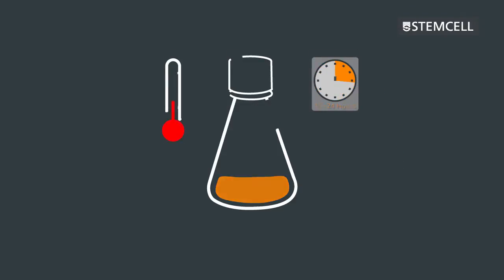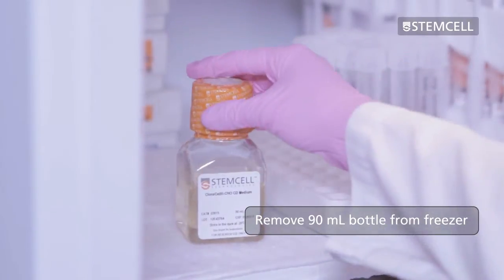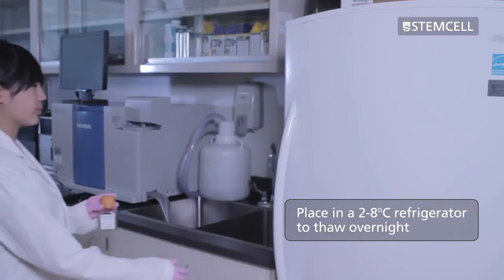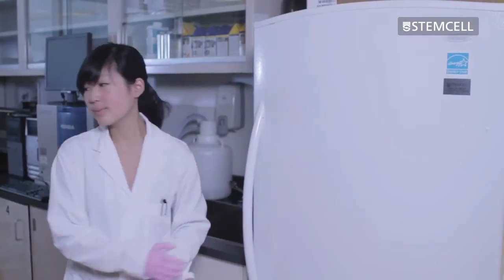On the same day as transfection, remove the 90 milliliter bottle of Clonacell semi-solid medium from the freezer and place it in a refrigerator to thaw at 4 degrees Celsius overnight. The thawed semi-solid medium will be required the next day.